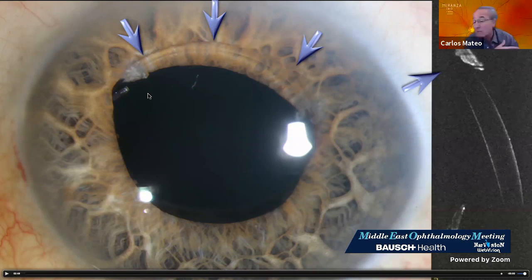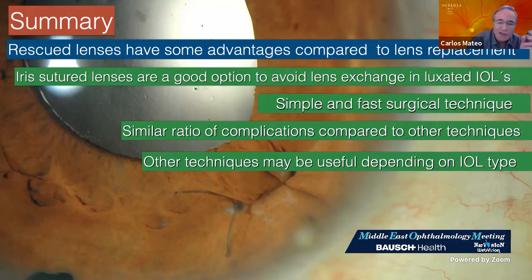I had one patient, operated 2 weeks ago, and yesterday, 2 weeks later, the lens was perfect. The patient had very good vision, but at the end this union between the haptic and the optical part broke. This is for me a problem. You have to choose the right lens at the end.